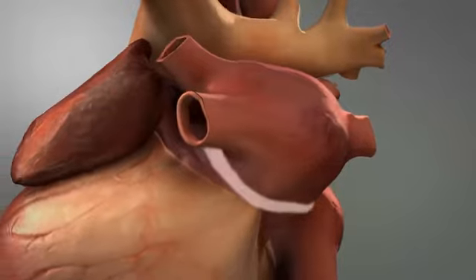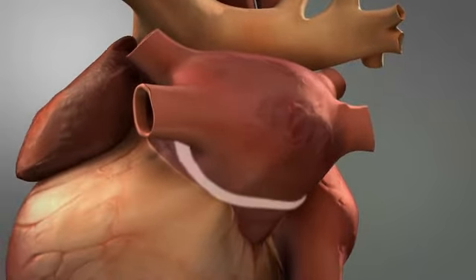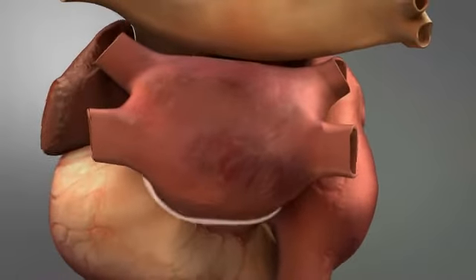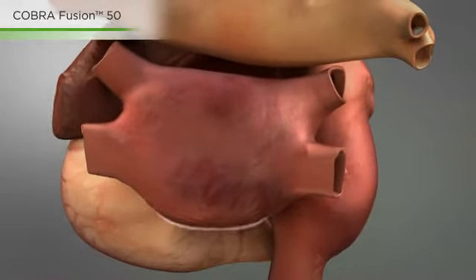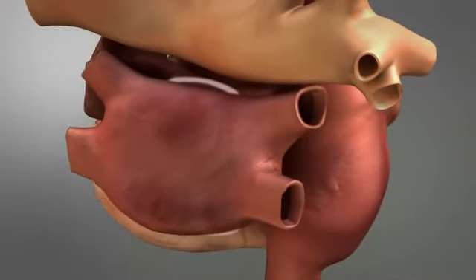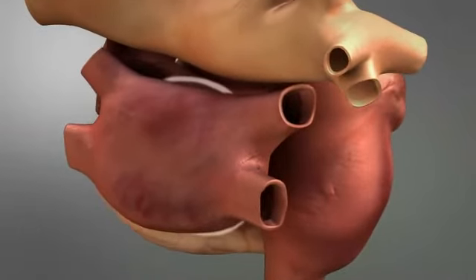Following the creation of the box lesion, the COBRA fusion 150 or fusion 50 may be used to create additional lesions, and the fusion 50 can be used to perform conduction block testing.